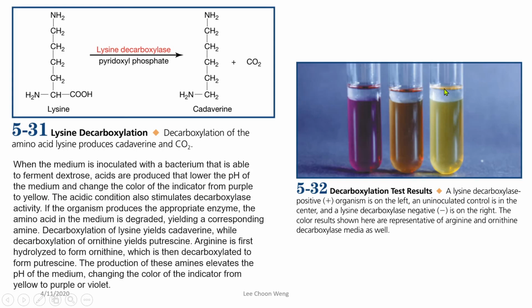If you do not have this control, you will not really know whether your bacteria is growing well or not. Okay, therefore it is better to have this pair of results, where your basal medium will be yellow and the one with the amino acid will turn purple.